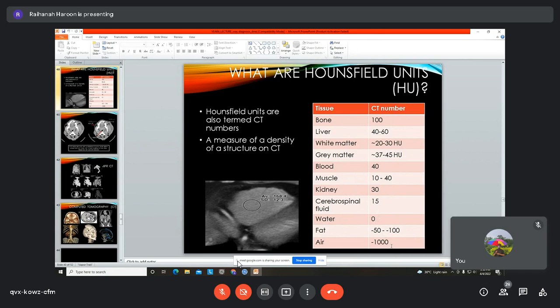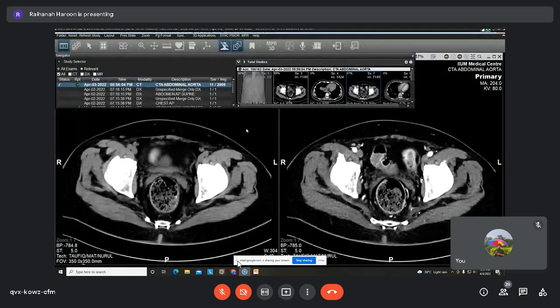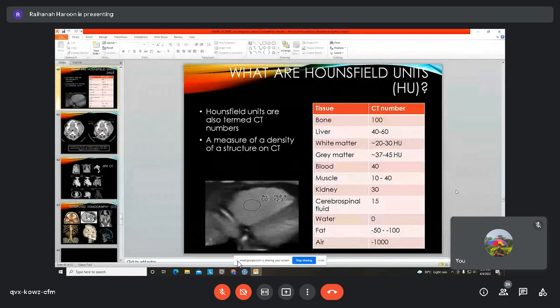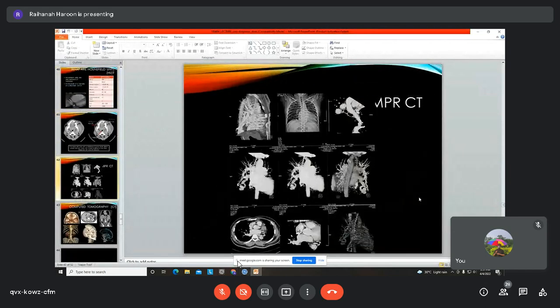And air here you put it -1000. You don't believe the graph? Just do here. Negative 998, close to 1000. The air surrounding the patient is also being irradiated by the CT scan. So, okay, this is just illustrating the same thing.